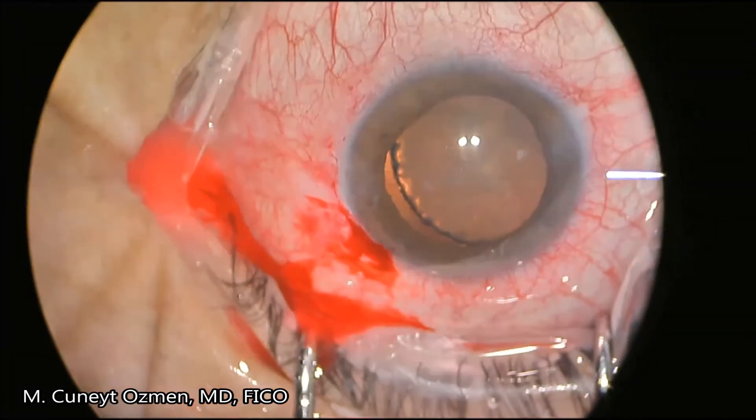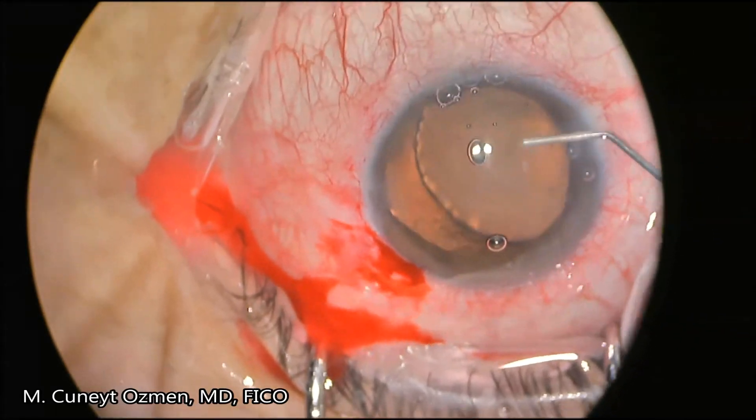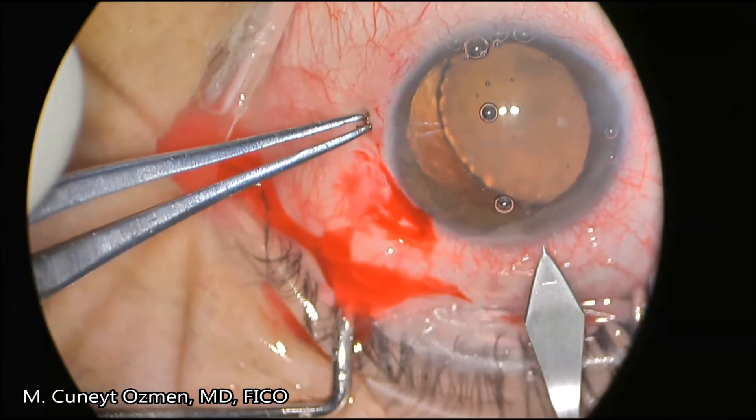However, we are actually very fortunate to see that after injecting an ocular viscoelastic device into the anterior chamber, the lens has stabilized tremendously.